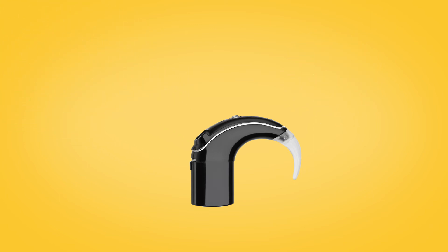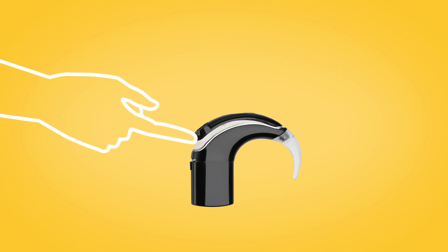To remove the microphone cover, use your fingernail to lift it from the bottom edge.